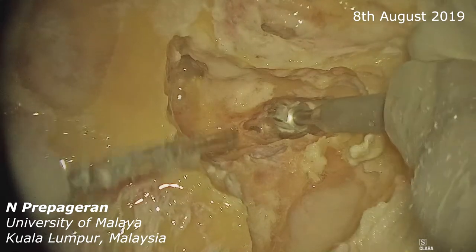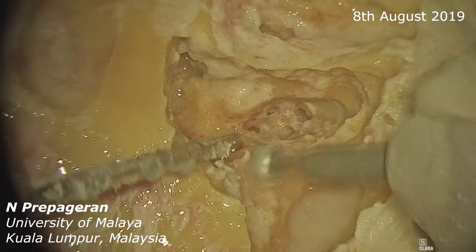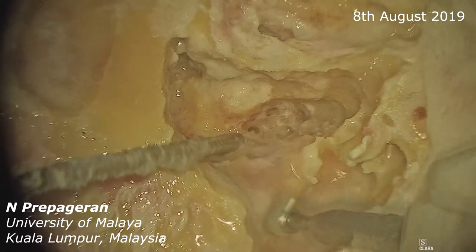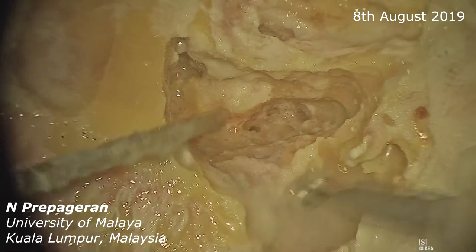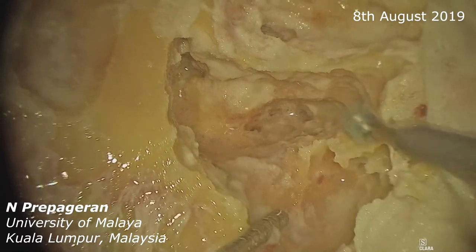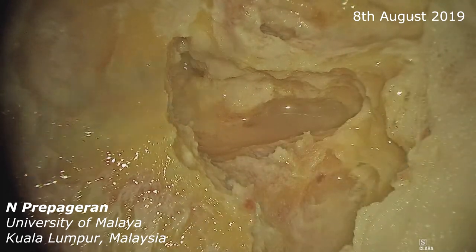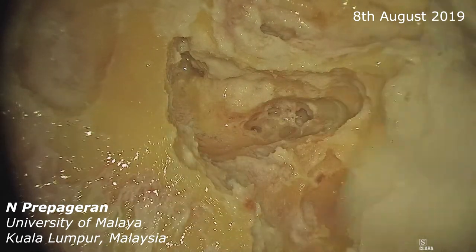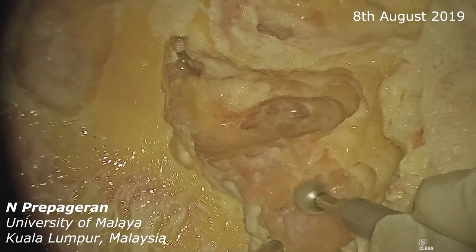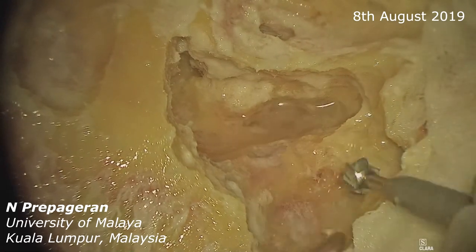So with this now, let me skeletonize the sigmoid sinus a little bit more. I'm using a cutting drill all the way, which is a bit more difficult to preserve structures. You can use a diamond drill if you want to — it'll be much easier to preserve structures. But I'm using cutting so that we can do it a bit more quickly. And there's the sigmoid sinus — that's the dura over the sigmoid sinus, retrosigmoid.